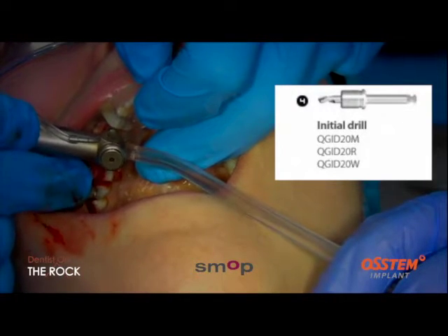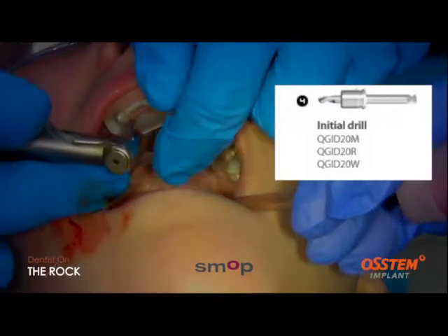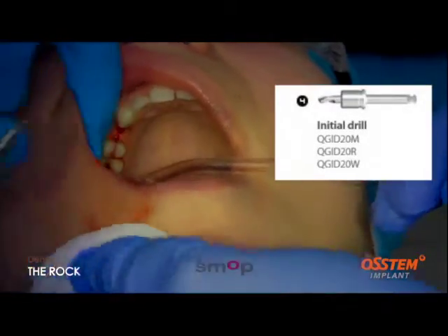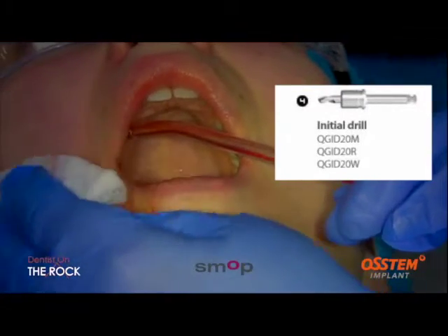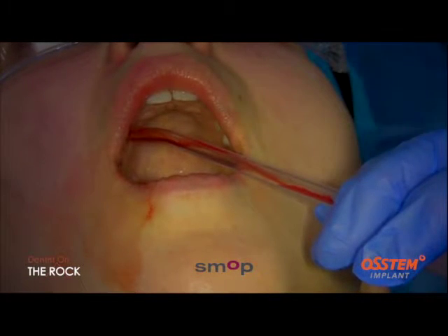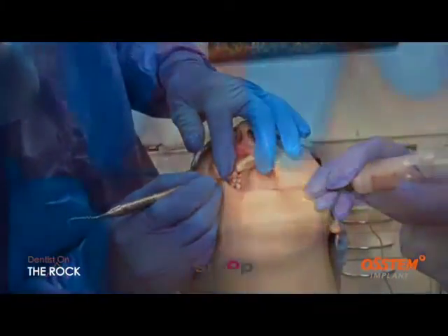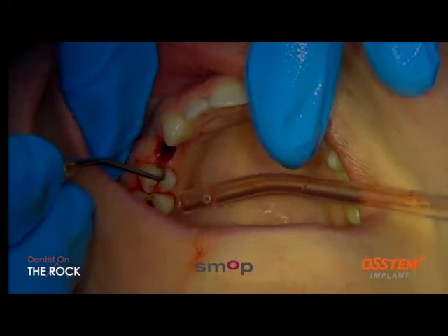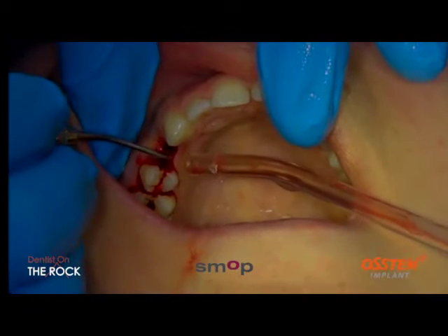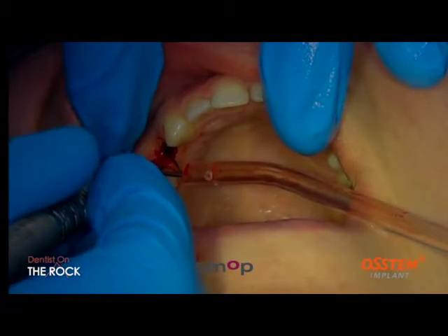And you can see whenever I'm using the drill, I'm always doing that pumping action that I described, just to let a little bit more coolant reach out all of the areas that I need to. Keep that on. Now, just because I'm a stickler for safety, I always check every step, making sure that I can feel the crest of the bone. It's going to be exactly where I want it to be, but I want to make sure that that is where I want it to be. I want to feel that there's a good hard crest there.